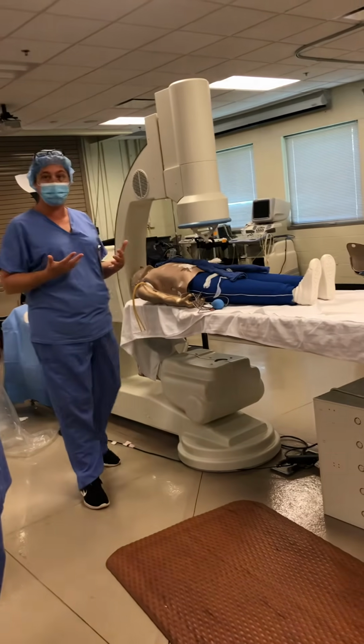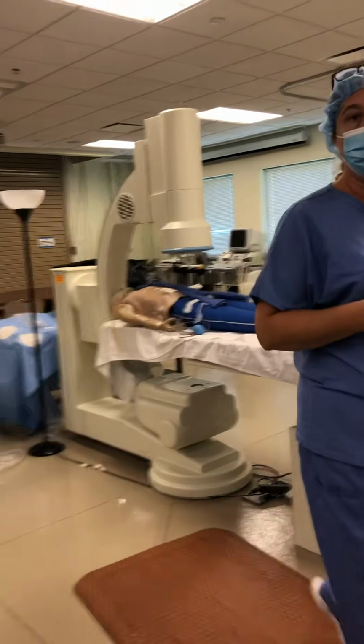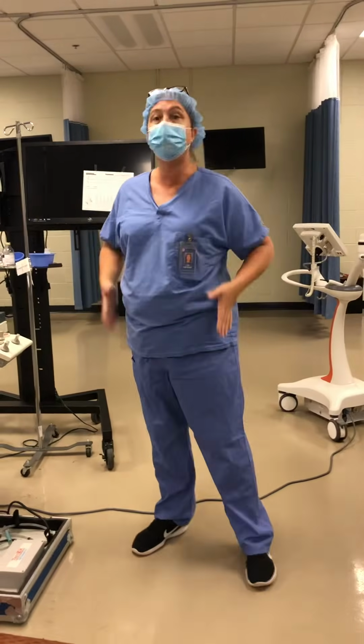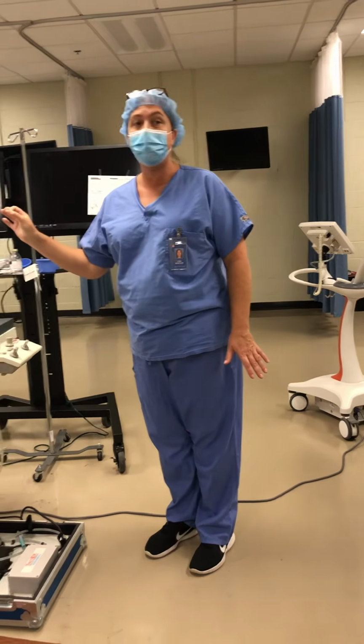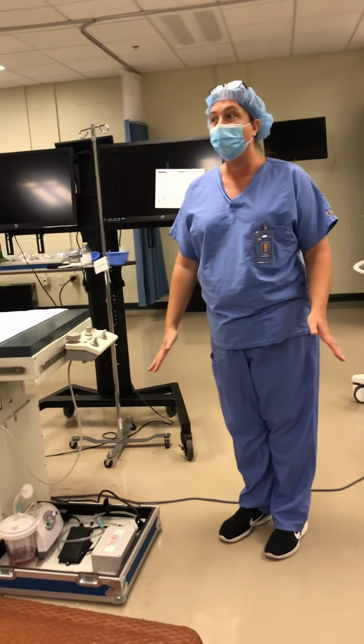But with the newer systems, as I said, we can scan all the way down to the legs. With the larger image intensifier, we can scan both legs at one time. With this one, depending on the size of the patient, with this smaller image intensifier, we may not be able to see both legs at one time.